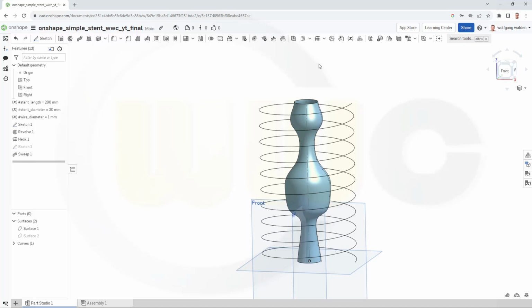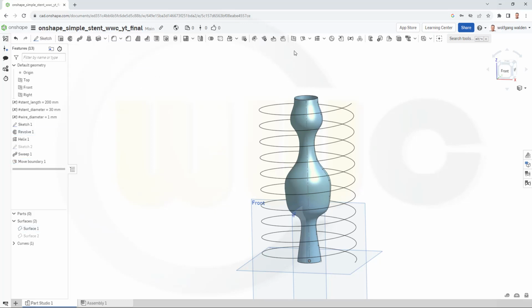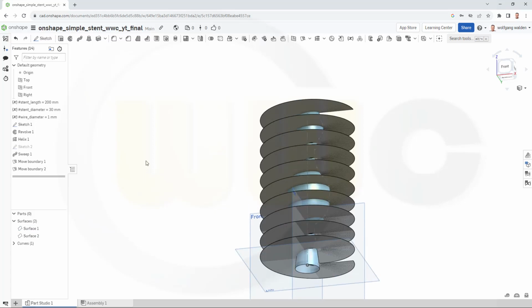Let's hide this one, bring back the first one, and I need to extend that here in order to split it correctly or to trim it correctly. So let's go for, it's over here, yeah, move boundary, this boundary maybe 5 millimeter, that should do. And again at the bottom, again 5 millimeter. Let's show both surfaces.